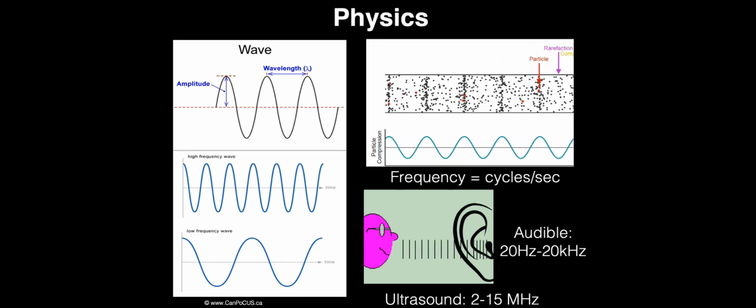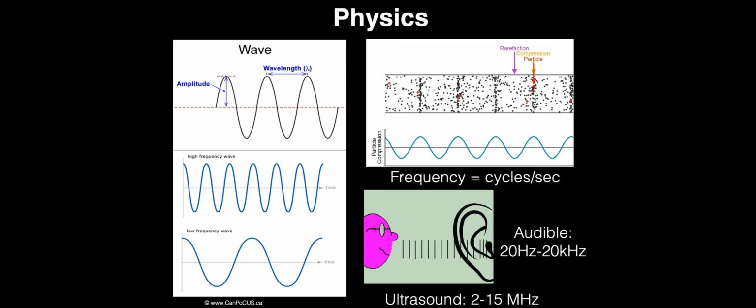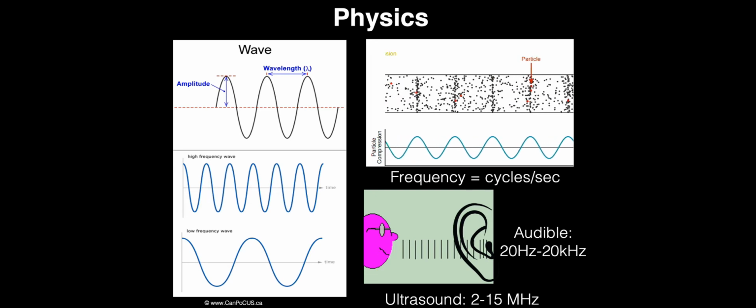The next frequencies you will hear are getting progressively higher. At some point, depending on your age, you will be unable to hear them. For those who heard it, the last tone played was 18,000 Hz.